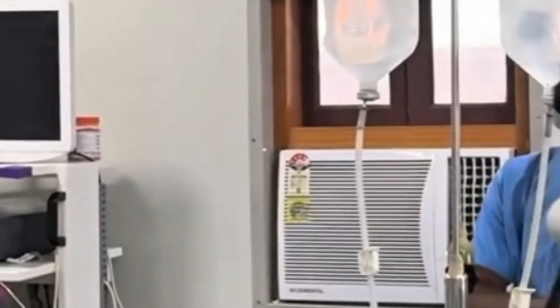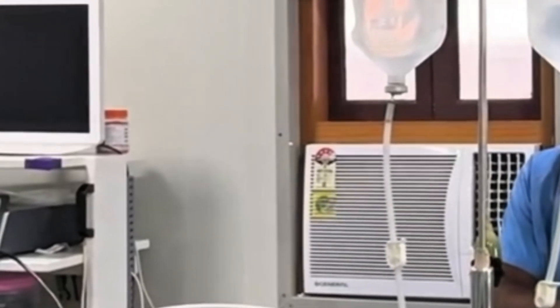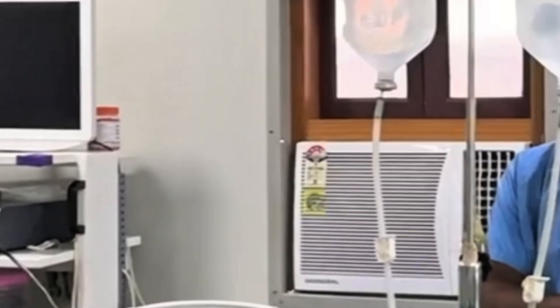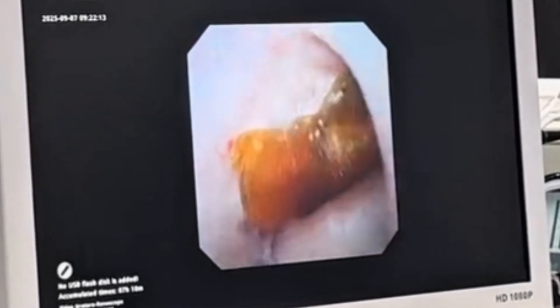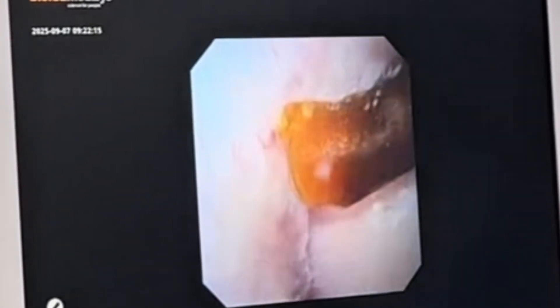You may also notice a white gauze piece being used here for white balance calibration. The normal saline irrigation system is now running, ensuring clear vision inside the kidney. The flexible ureteroscope allows us to reach every calyx tier — upper, middle, and lower poles of the kidney.